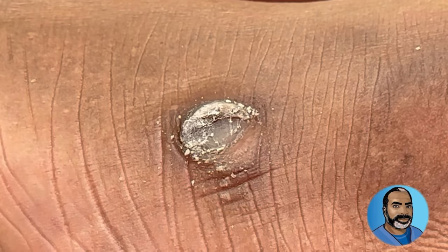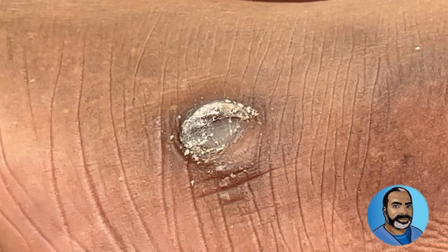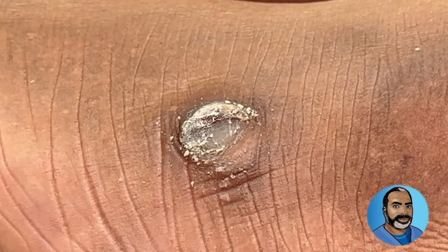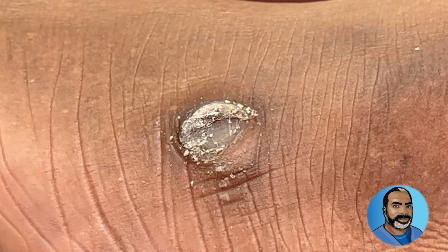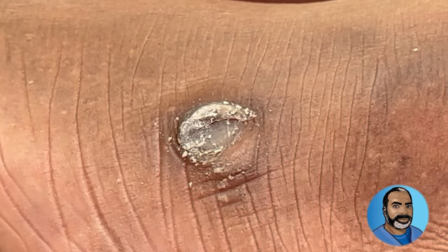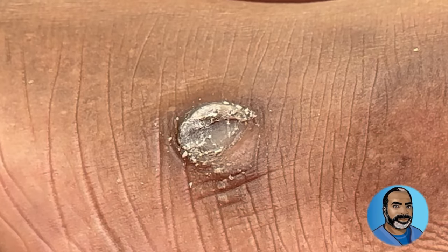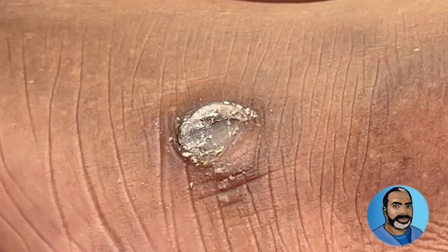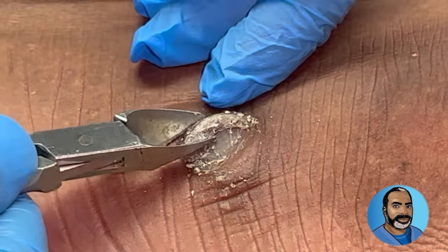So it was just something hard that needed to be removed? Yeah. And what do you call it? A cutaneous horn — c-u-t-a-n-e-o-u-s horn. Just got a little bit more here at the base before I bring the blade in.